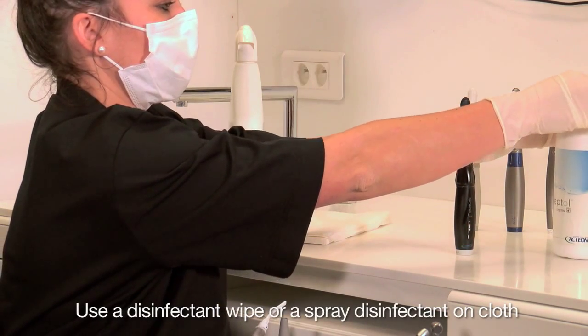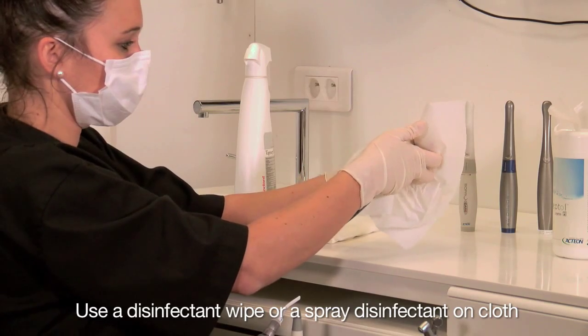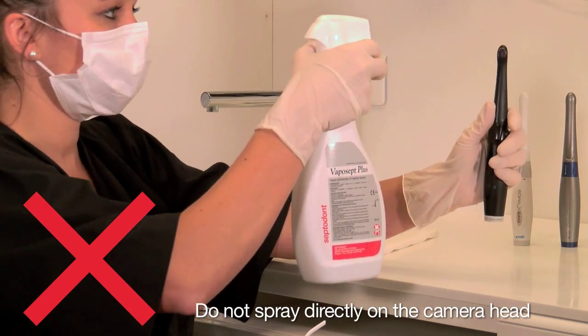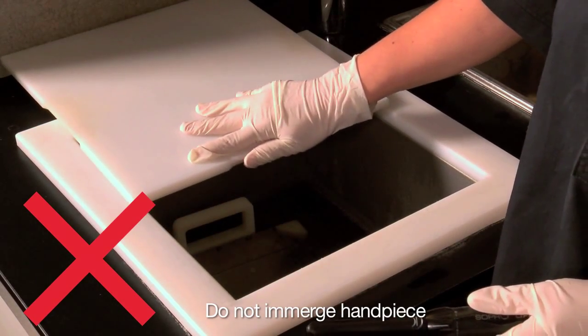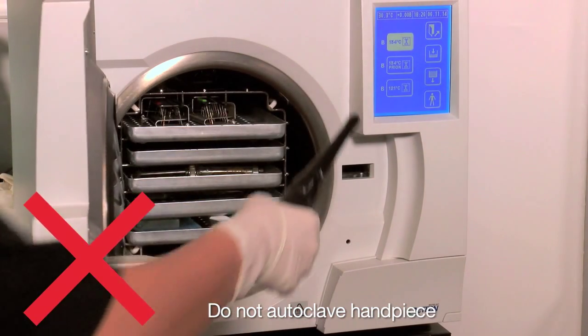Use a disinfectant wipe or a spray disinfectant on cloth, then clean the handpiece. Do not spray disinfectant directly on the camera head. Do not immerse the handpiece. Do not autoclave the handpiece.